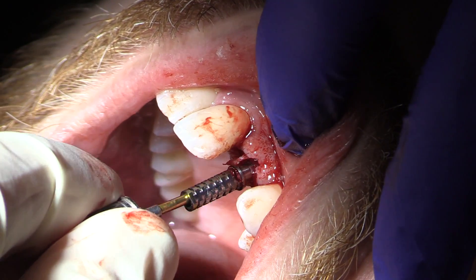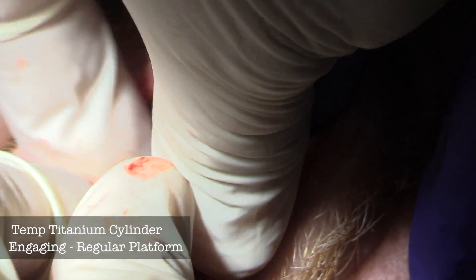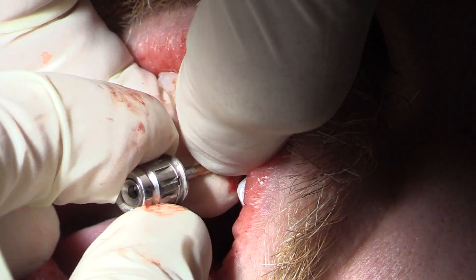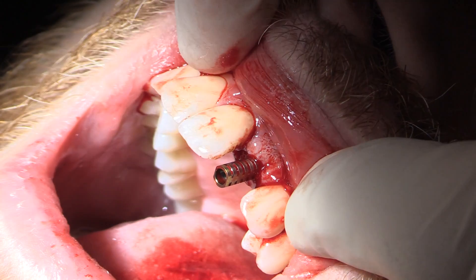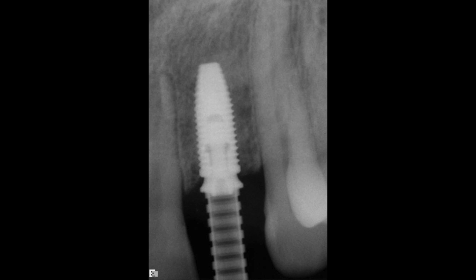We take the bone mill abutment off and start to try our abutment. The abutment will now fit down — there's no way this would have fit before. This is a titanium cylinder that I use to make temporaries, and it would not have fit down; you would have a problem and be trying to cut this with other drills, possibly nicking the implant. Proper tooling and instrumentation is so important. You'll see that this is now going to be in a position going to the incisal edge, so I'm going to make an ASC crown — an angular screw channel — putting it in the proper spot. Look at the bone around this implant: even after doing this CC bone mill, we've got bone at the exact top of the implant — simply fantastic.